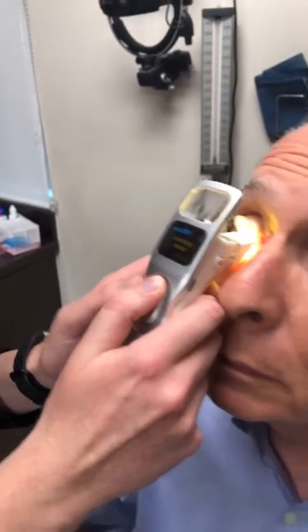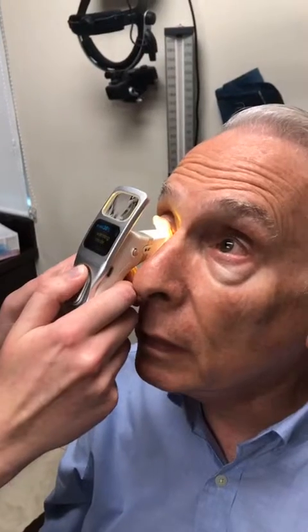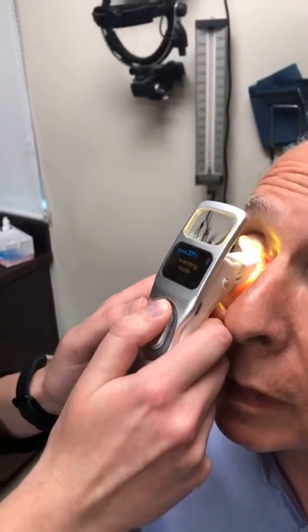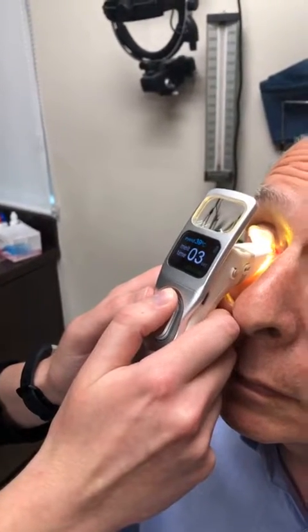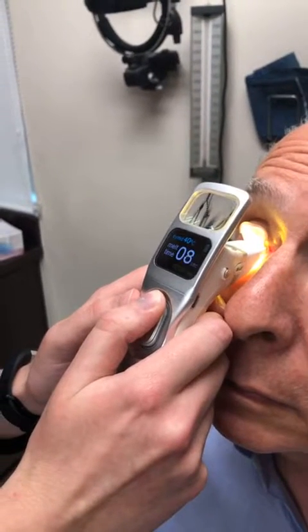It feels comfortable. No pain? I have no pain. I can feel the heat. It feels nice — a very nice sensation. Good. So now it's at 38 degrees Celsius, and we're going to wait about 40 to 60 seconds.